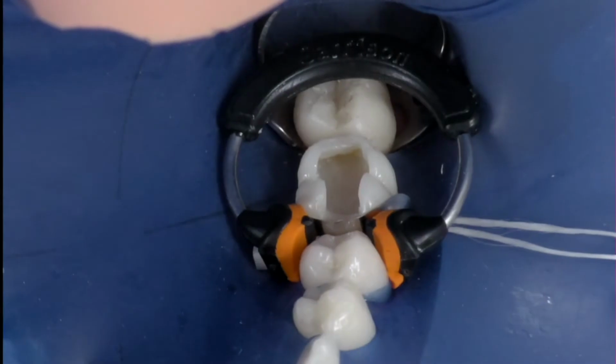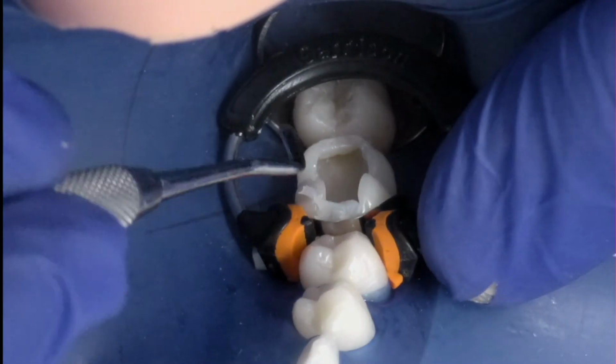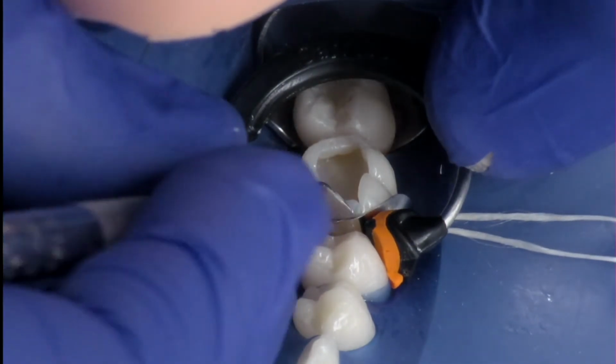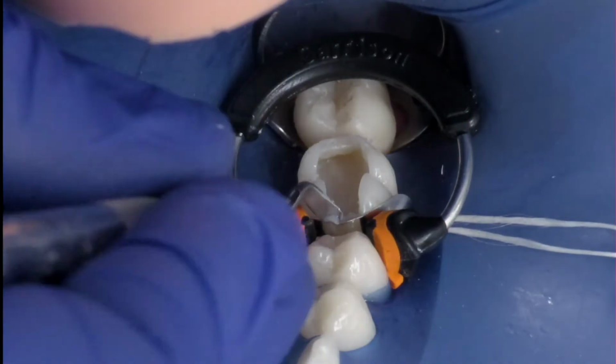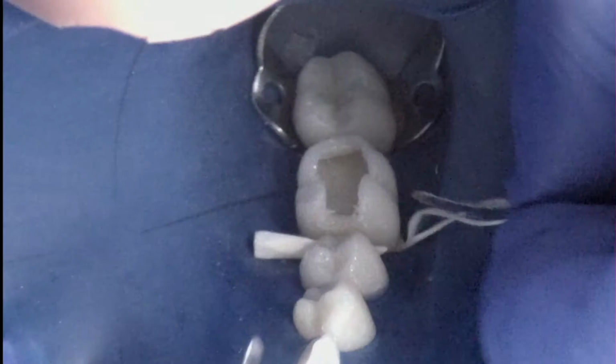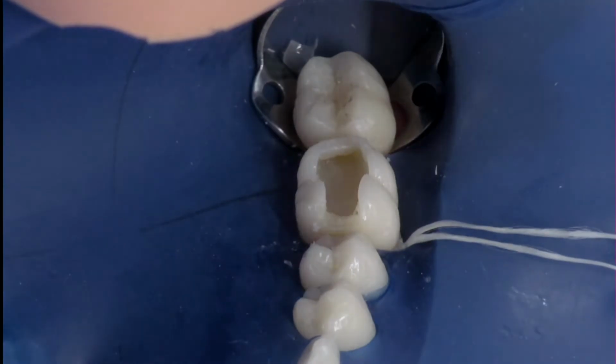Now, in this following step, I'm going to attempt to put an enamel shade as a final increment on the marginal ridge, but then I realize that I'm above the proximal tooth's marginal ridge, so I just tear it out, and I realize I'm going to have a dark layer on that marginal side. I probably would have avoided that if I would have cut the matrix band down to about the exact height of the proximal tooth's marginal ridge.